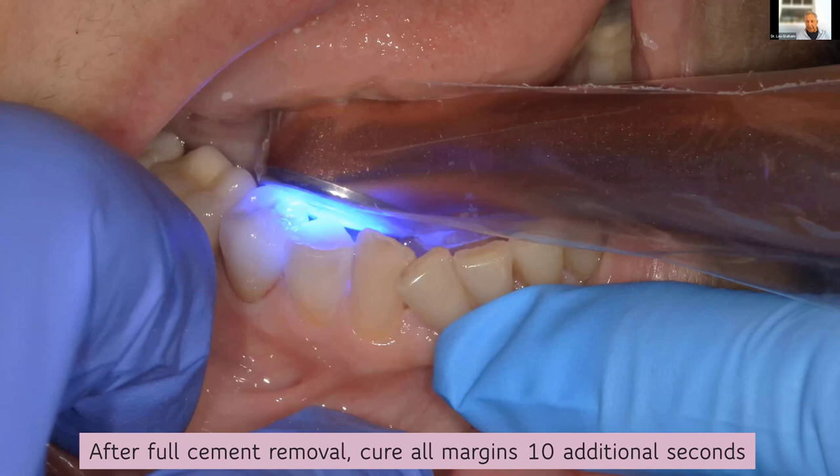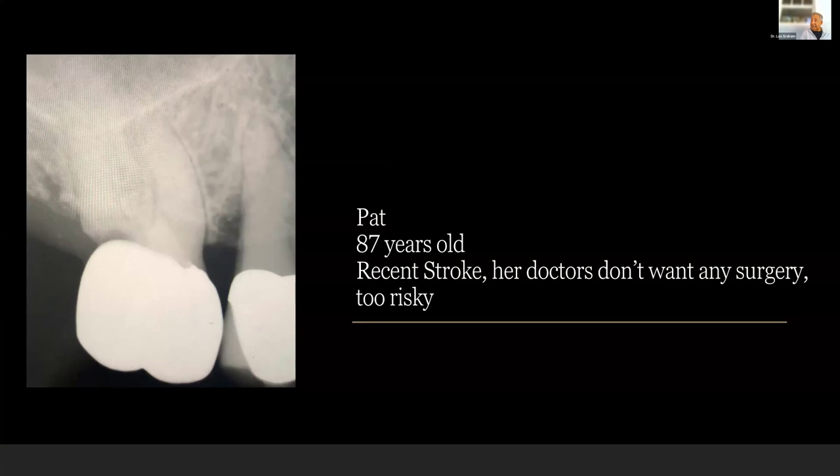And this is the beauty of zirconia today. My last case — I want to be cognizant of time. This is Pat. I'm very much involved in geriatric dentistry. I've been in practice 35 years — all my patients got old. Pat is 87 years old and she had a recent stroke. Her doctors don't want any surgery — no crown lengthening, no extraction, nothing. But she has pain on this tooth. Here's geriatric caries: 2018 look at the distal, no caries; 2020, lots of caries.